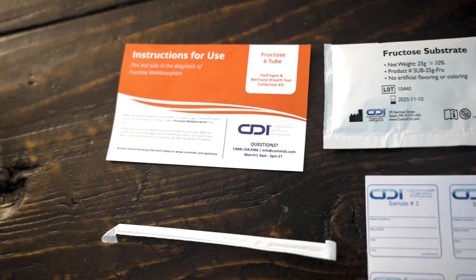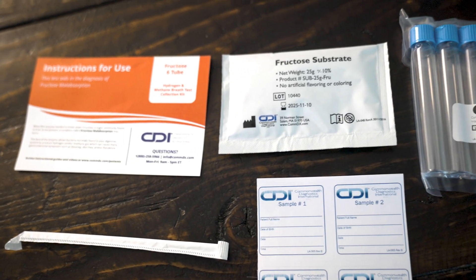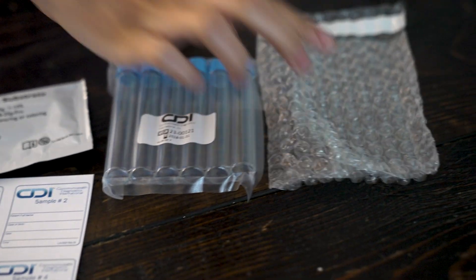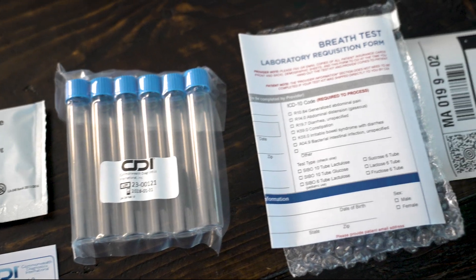Before testing, let's review the contents of your test kit. Your kit includes a straw, substrate packet, six breath test tubes with labels, a bubble wrap packet, a prepaid shipping label, and a requisition form.